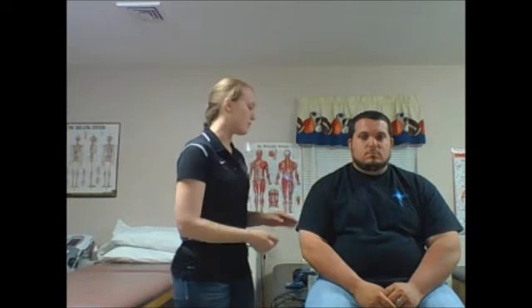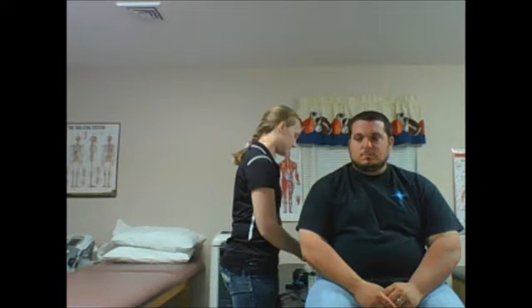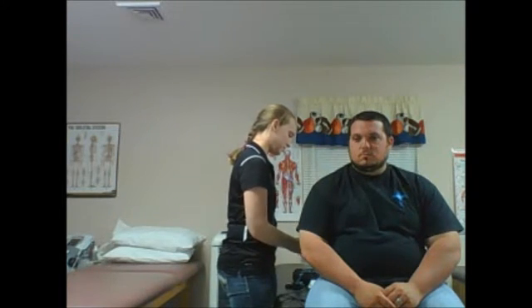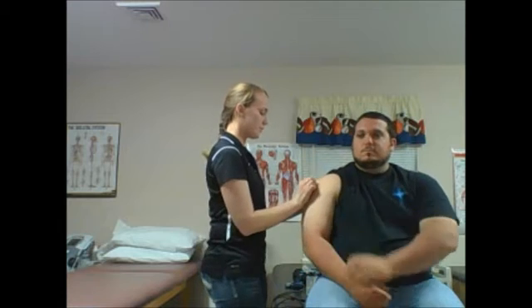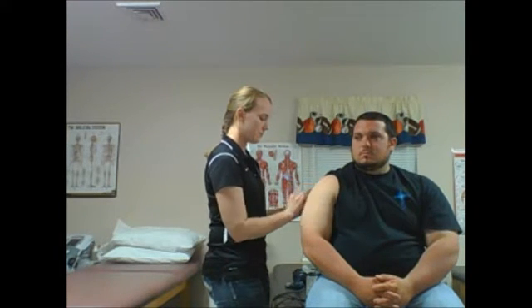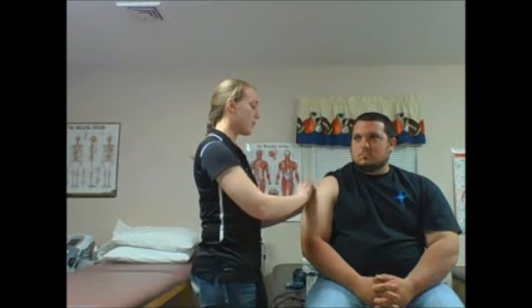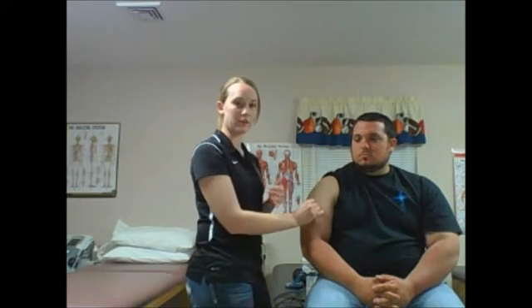Okay? And then you're going to want to clean the area properly using an alcohol pad. And you don't want to use one that's already been used or that's open. So you want to start with a sterile pad. And while cleaning the skin, you also want to check and make sure that there's not any irritation or anything that would contraindicate using and applying Iontophoresis. I'm going to let that dry for a second.